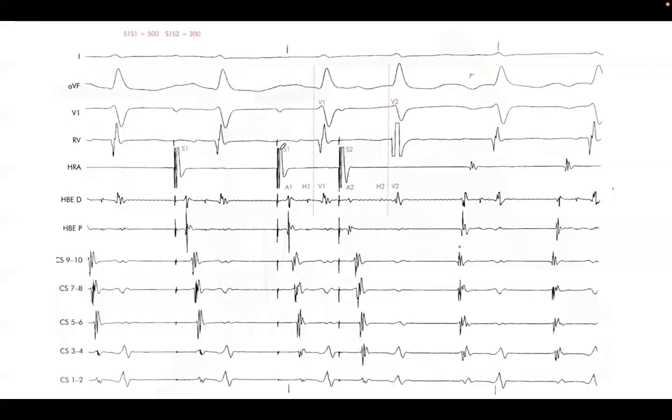Okay, A pacing, A H V, okay? A pacing, there is change in the AH interval. Slow pathway. Jump. I'm not giving you numbers, so you cannot tell jump for sure, but there's clear AH prolongation, right? And the QRS looks the same. There is no hint, there is no evidence of accessory pathway, at least so far. And you have to measure the HV.